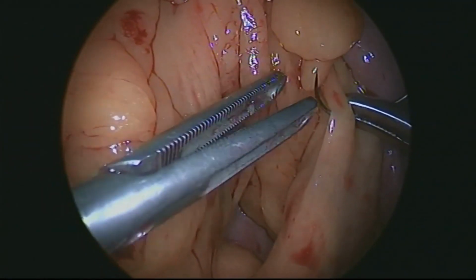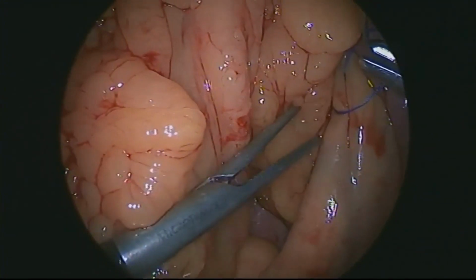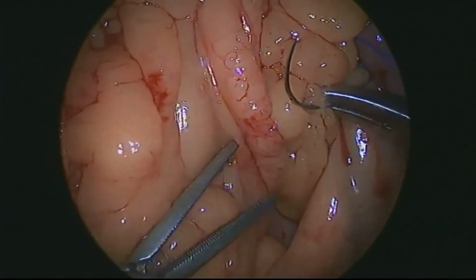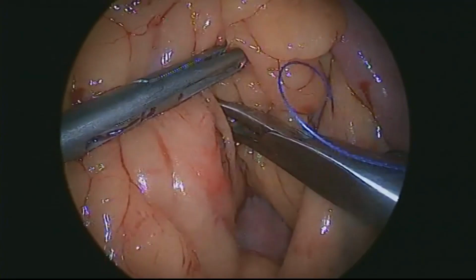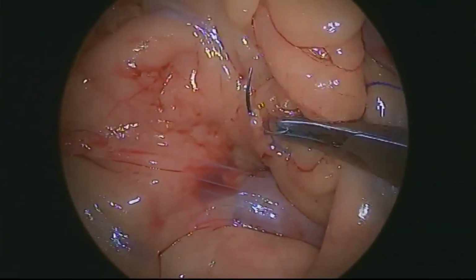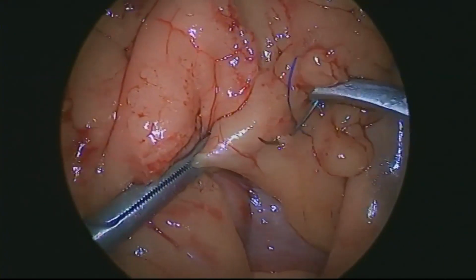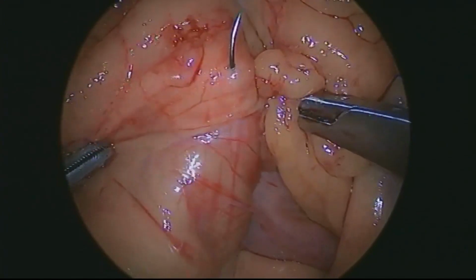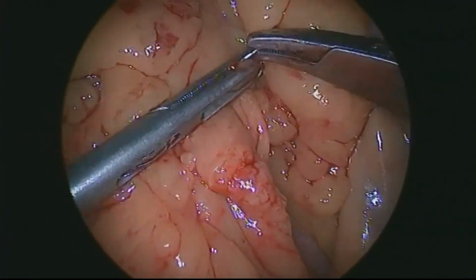We start by taking a bite on the mesentery of the efferent limb, very close to the bowel. Then, again under good visual control of the transverse colon, we place a stitch in the mesocolon itself, close to the transverse. And then from there on, we're going to go more towards the right of the patient, taking little bites in the transverse mesocolon until we reach the angle of Treitz, still in the mesocolon though.